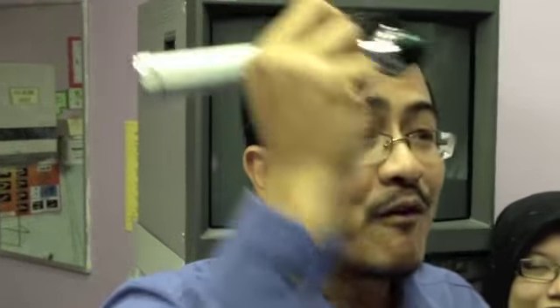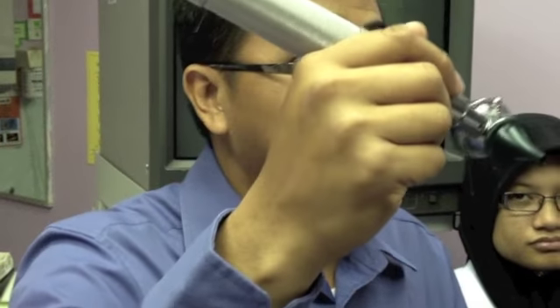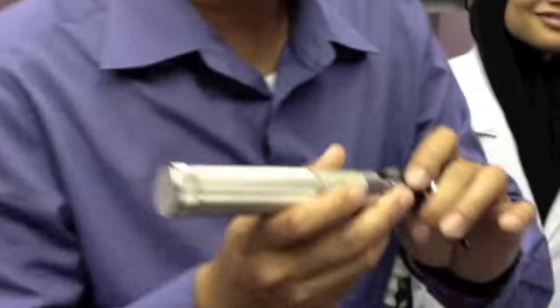Alright, see. How do you hold the otoscope professionally? If you hold like this, that means that you have not been through the ENT posting. This is not the way to do it. Okay, I don't care. Alright, they say is it comfortable like this or not? But this is how you do it. Hold like a pen. I know some people who hold the pen like this. But this is the way you hold the pen, right? Alright, this is how you hold it.